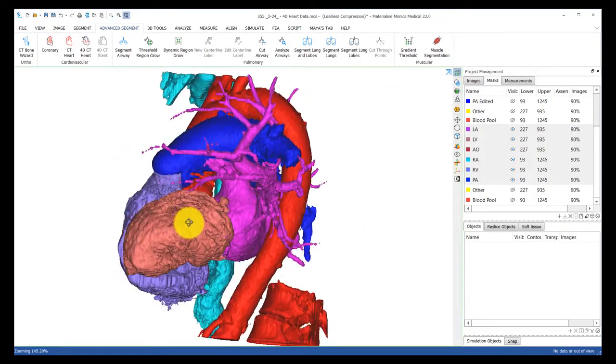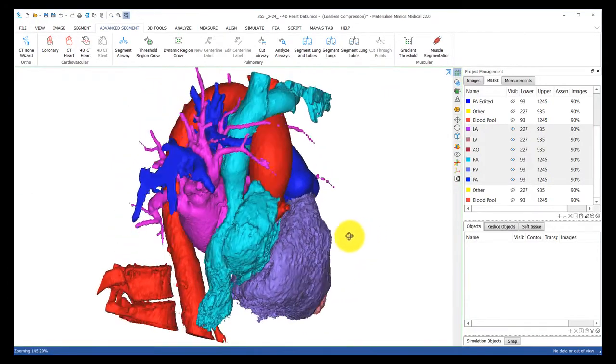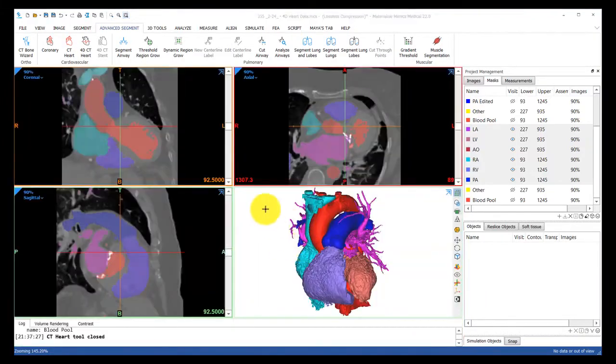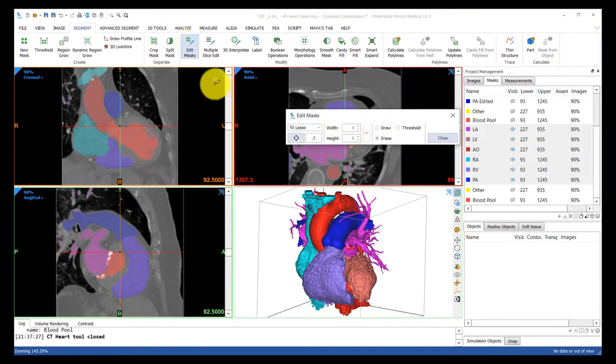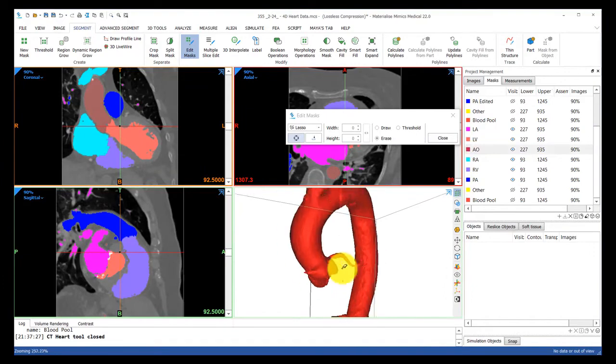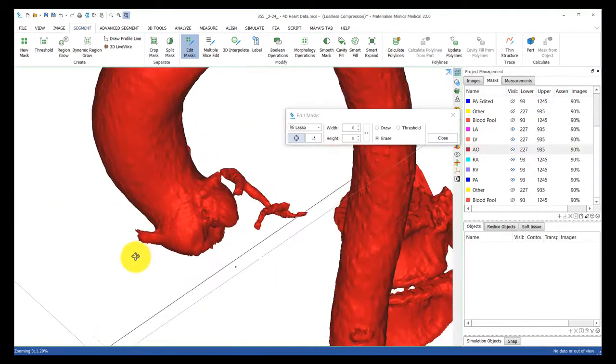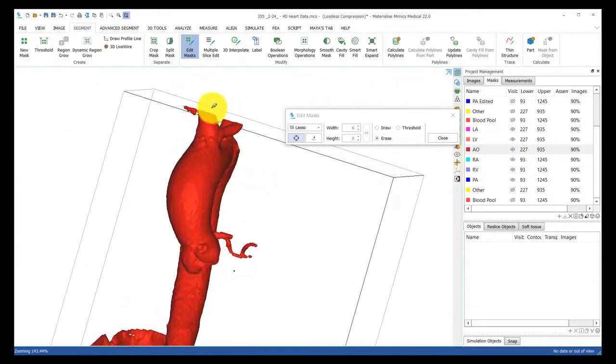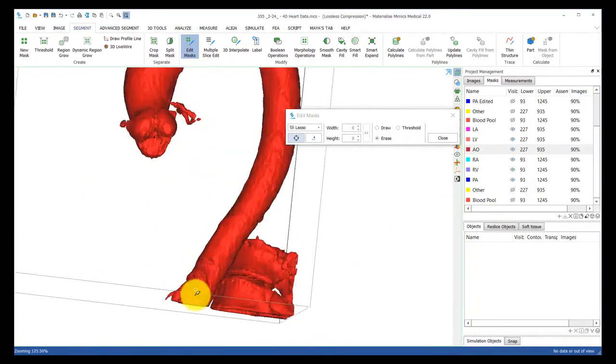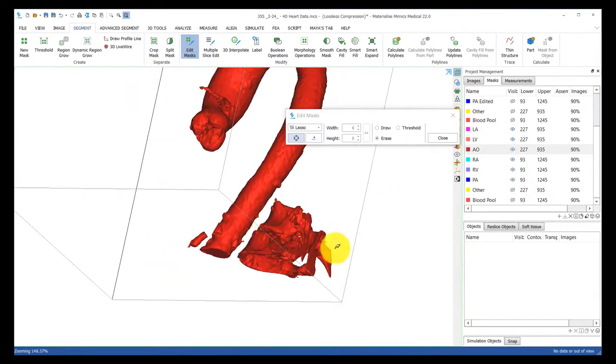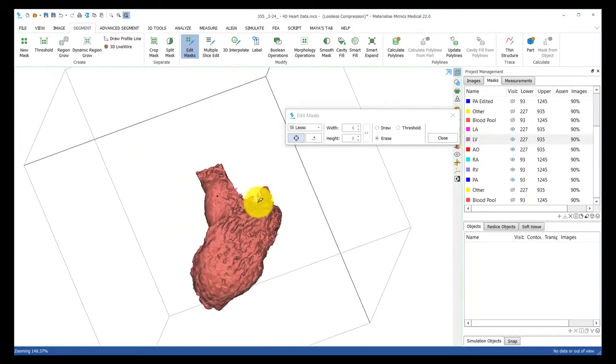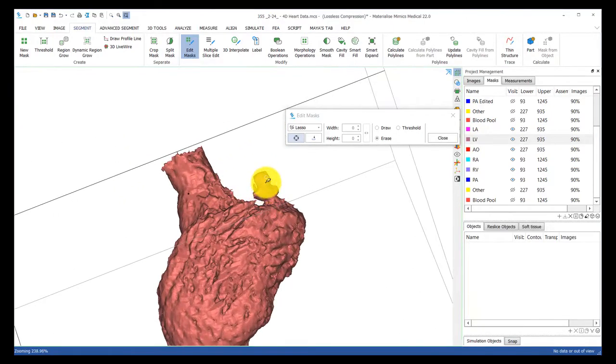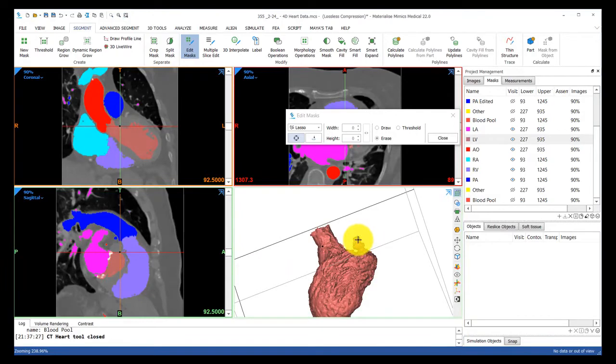Now you can see we have some messy branches and other items that we maybe don't want in our model. So let's edit these masks using the edit mask tool under the segment tab. Basically what I'm doing here is cutting off some of these unwanted or incorrect aspects of the mask.